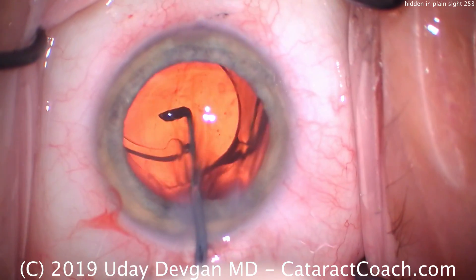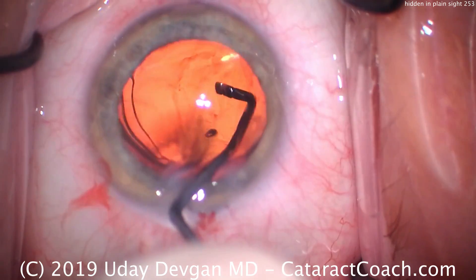Is it the haptic? No — we eventually opened that haptic up. It was stuck to the optic, but that's not it.